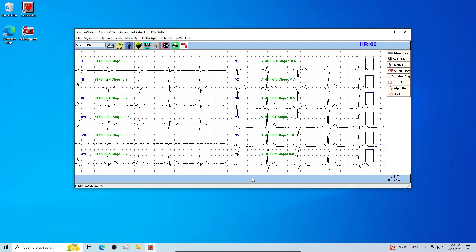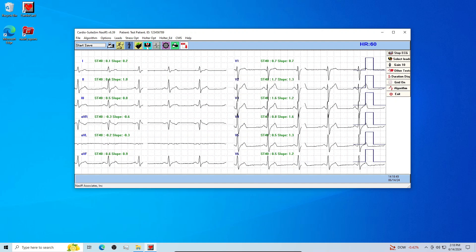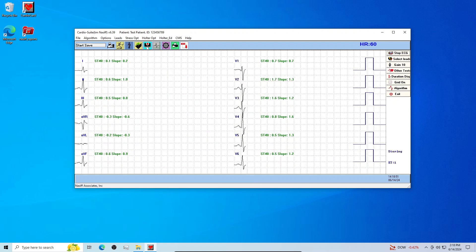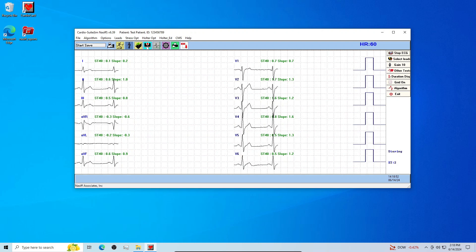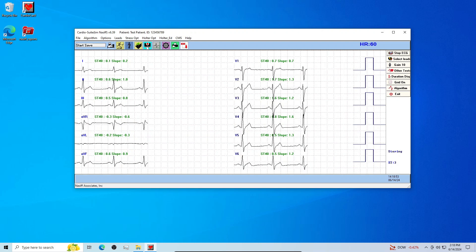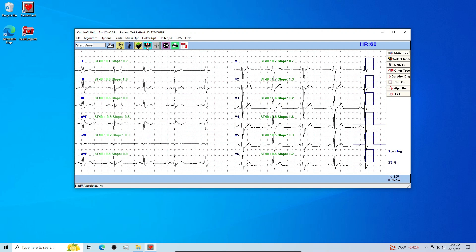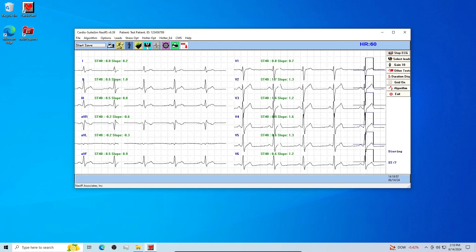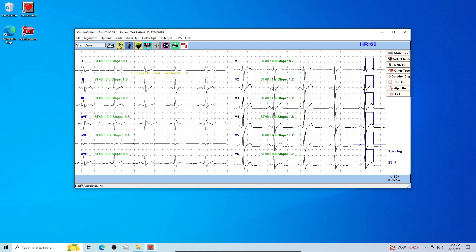And as soon as you are ready, click on the light blue Start Save button. This will begin storing the ECG signal. Allow the system 10 plus seconds to save the ECG report.